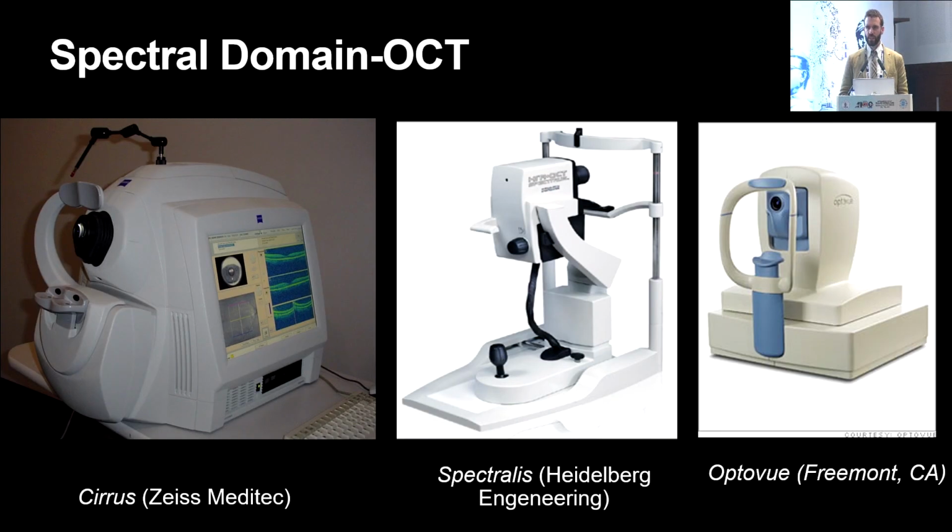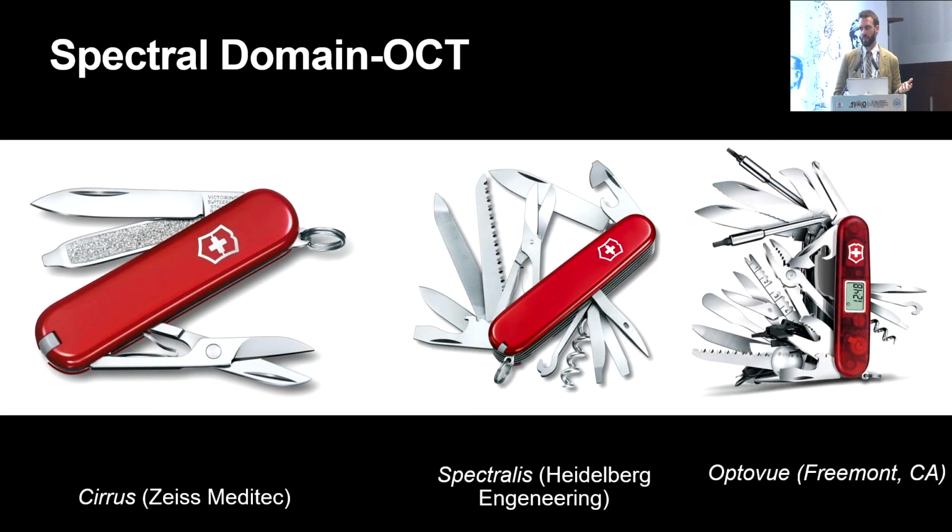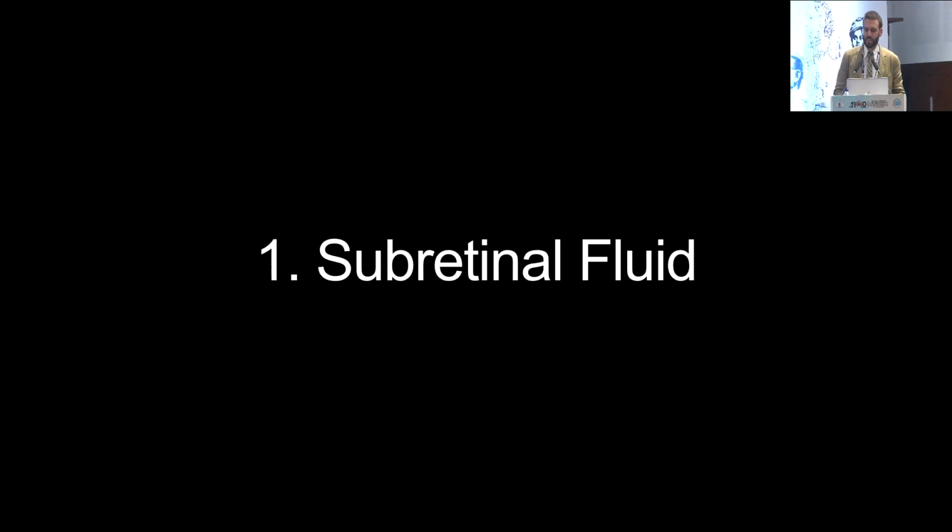So I just told you in the previous presentation that OCT is basically the Swiss Army knife of an ophthalmologist. We could diagnose stuff just by OCT. Now I'm going to tell you the opposite, basically. So I'll just start by presenting cases.